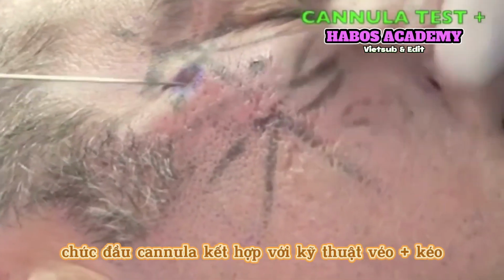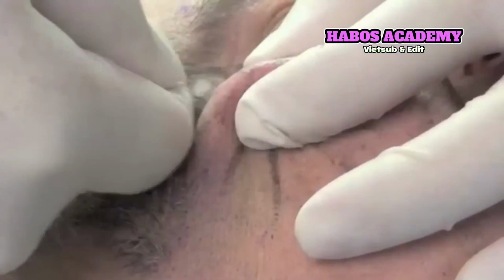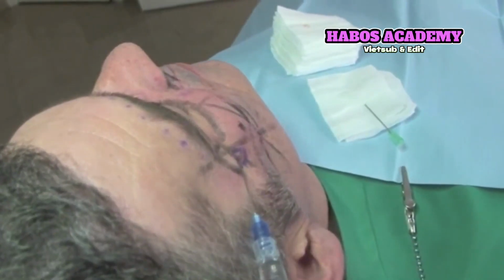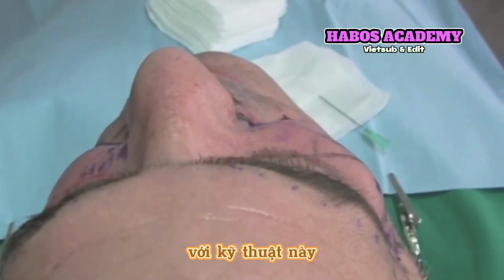a pinch and pull combined with a deep vector will push the cannula through the prezygomatic capsule. That popping sound confirms passage into the prezygomatic space. From a bird's eye view, we can see the excursion of malar tissue giving the tent effect for cheek projection.